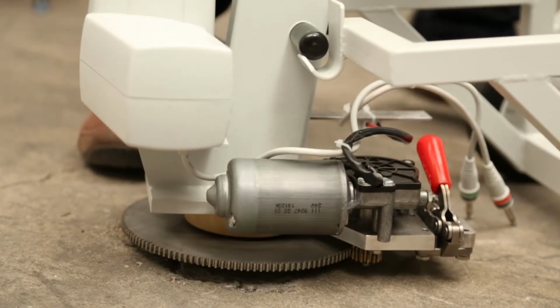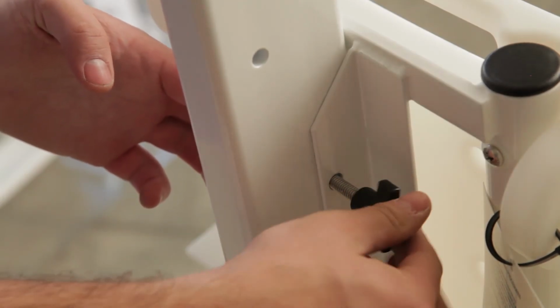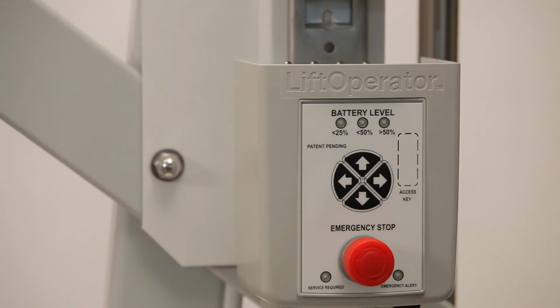Insert the lift back into the anchor, then replace the lift cover. Reattach the seat assembly and reconnect all of the cables to the control box. Finally, reinstall the battery.